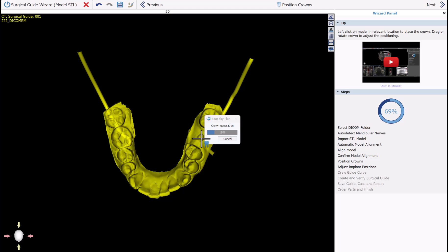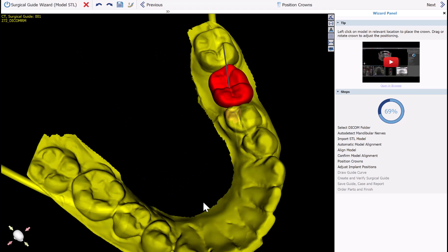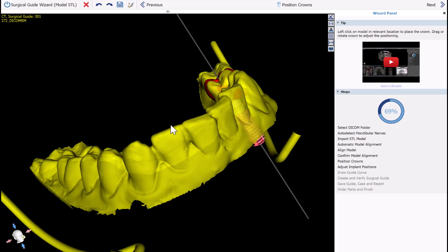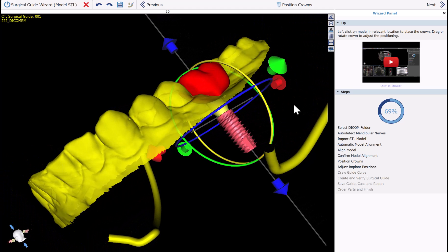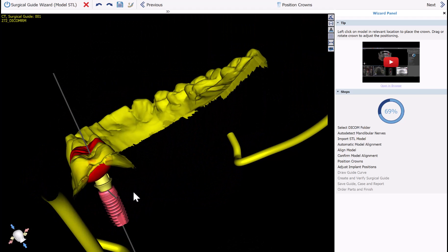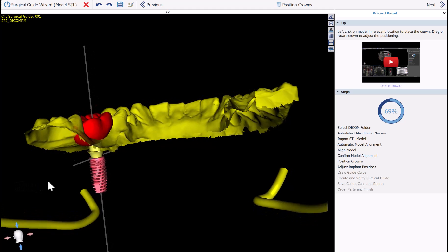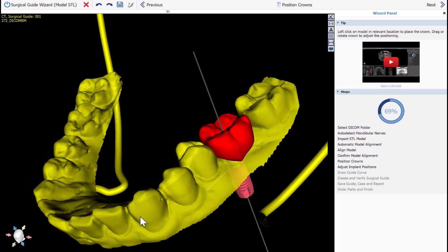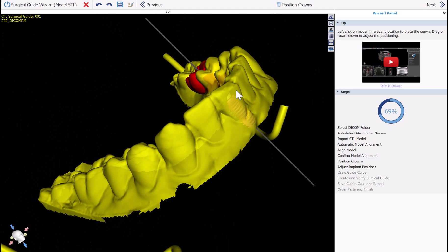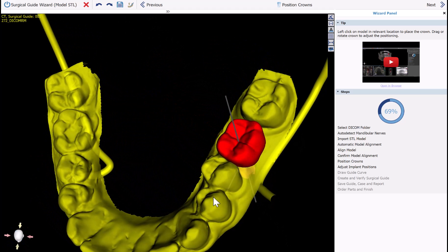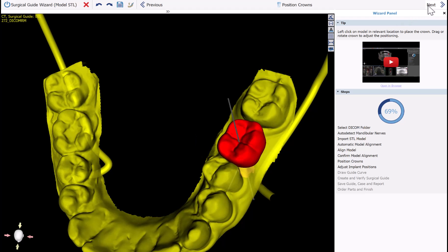The software is now running the automatic tooth generation. We can see that the software has generated a tooth particular to our case, placed in the correct position, with the abutment and implant placed as well. This is the first iteration of our automatic tooth generation, so if you run into any issues or problematic cases, please send us a data set so we can continue to improve. I'm now going to click Next.